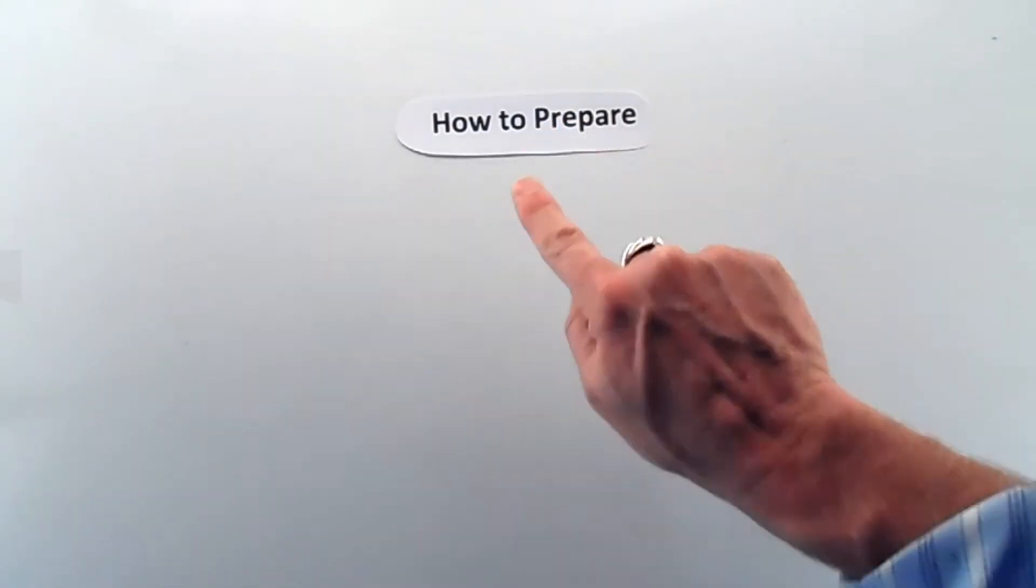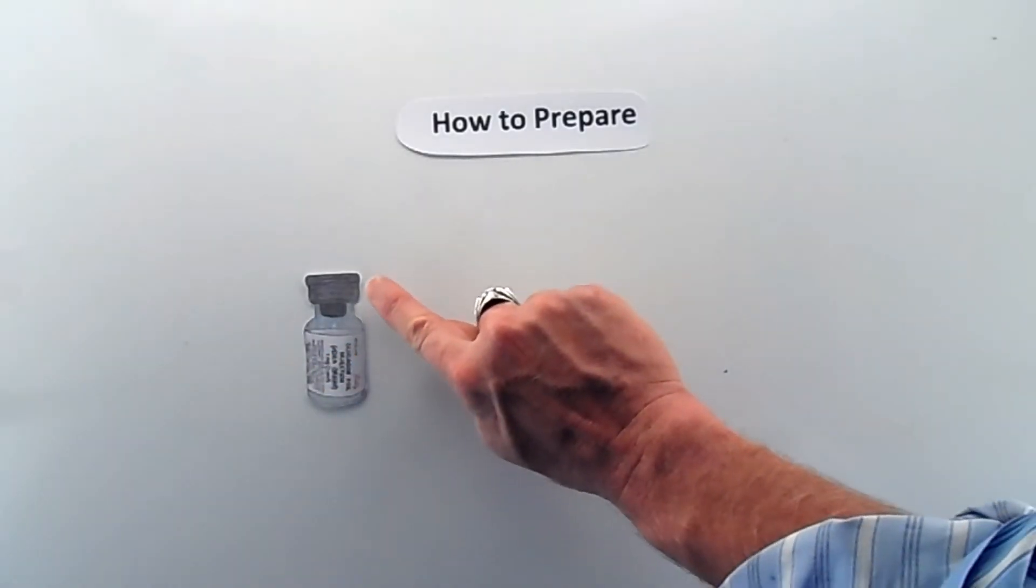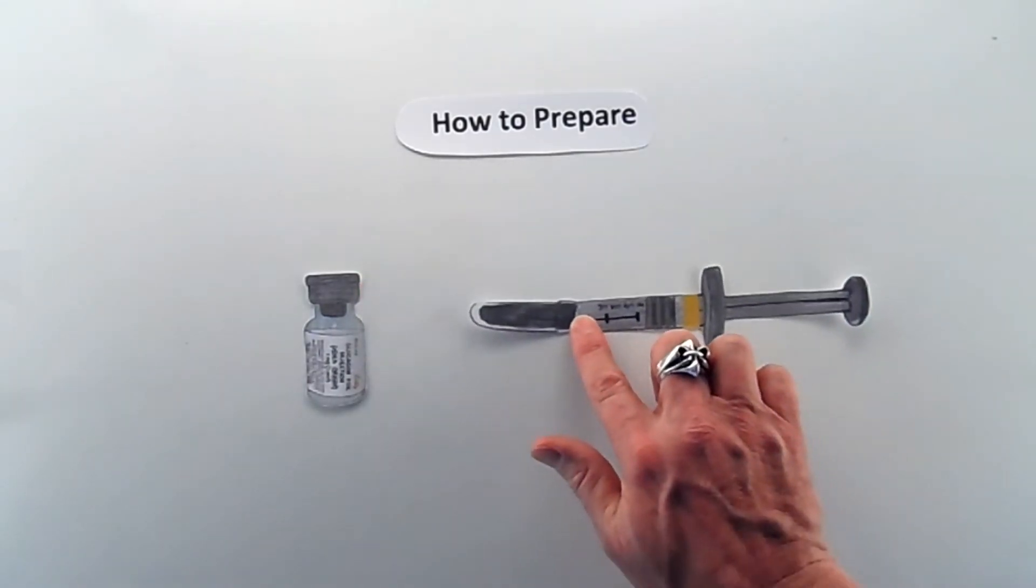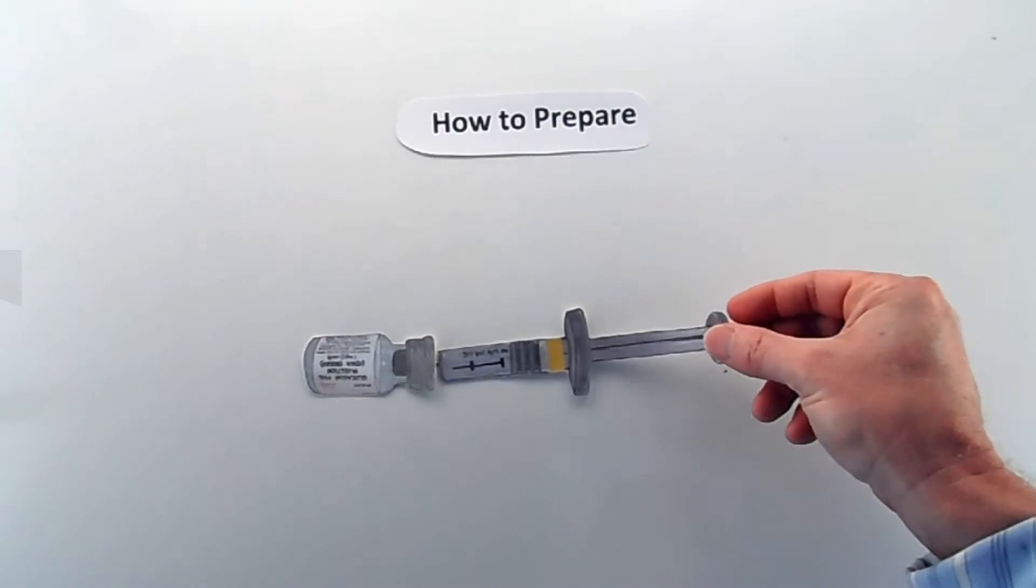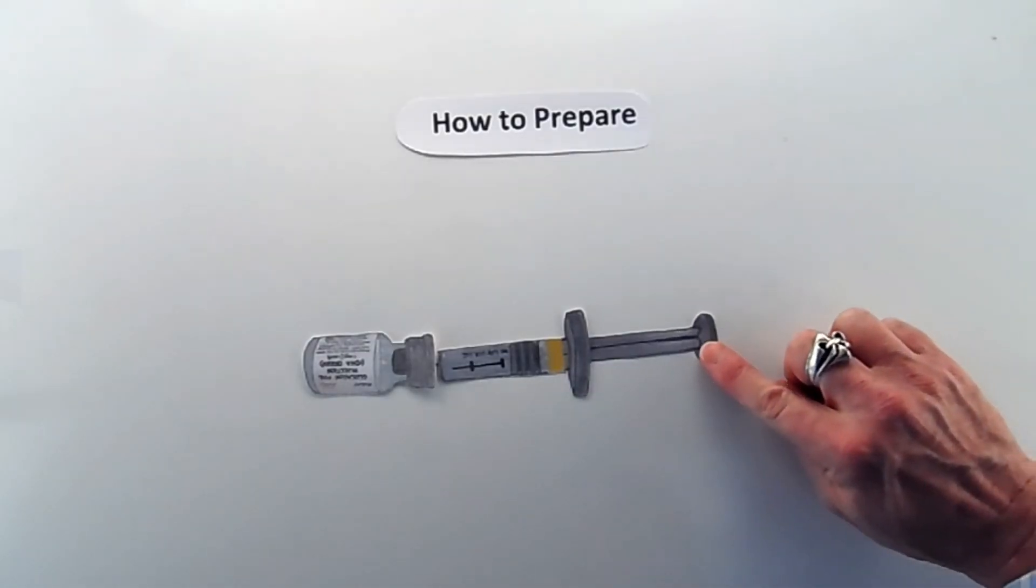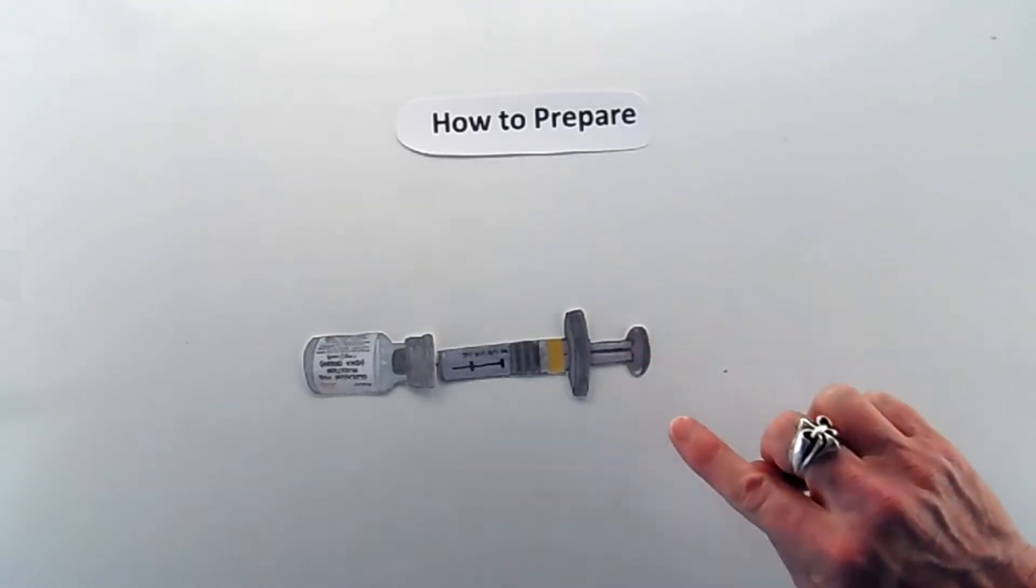So now you need to prepare it. First, you'll need to remove the seal from the vial containing the powder. Next, you'll remove the needle cover from the syringe. Then you'll insert the needle into the vial and inject all the liquid from the syringe, essentially mixing the liquid with the powder.